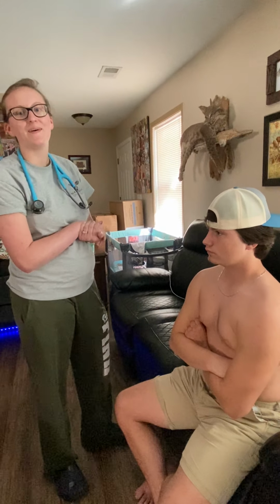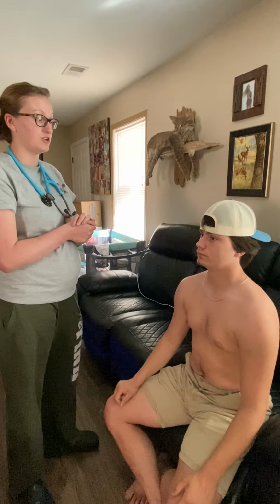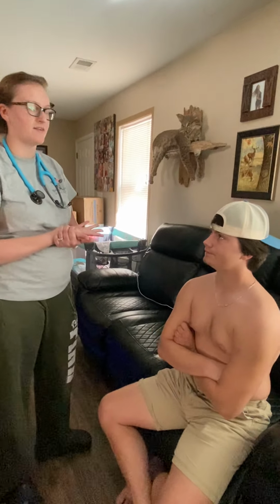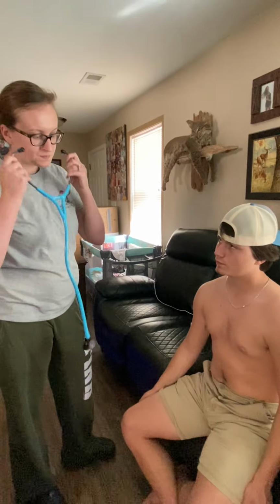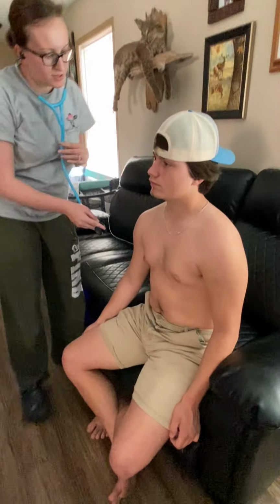So I'm now going to take a listen. First I'm just going to get you to take another deep breath for me. Can you do it with your mouth open? Okay, so doing that, we're just going to be listening for any adventitious sounds, any wheezing or stridor, and we didn't hear any. And now I'm going to listen at all lung fields. Alrighty. And we'll start anterior. You just take some deep breaths for me.